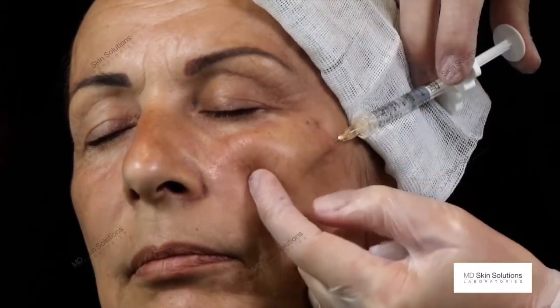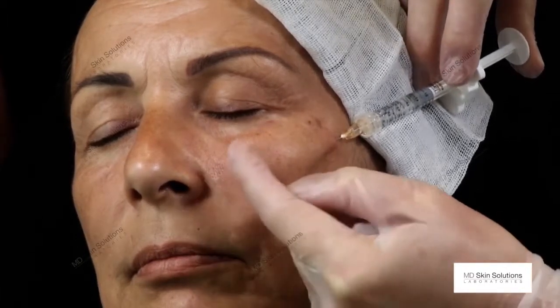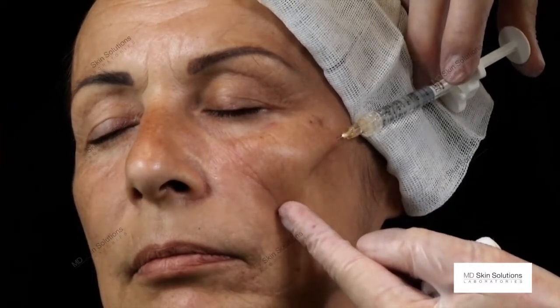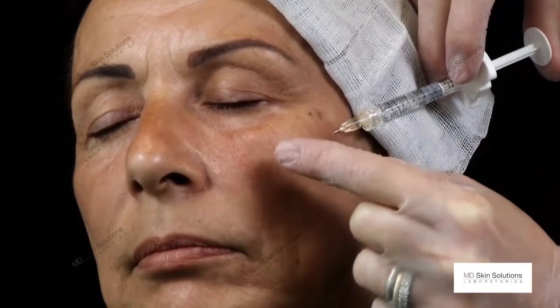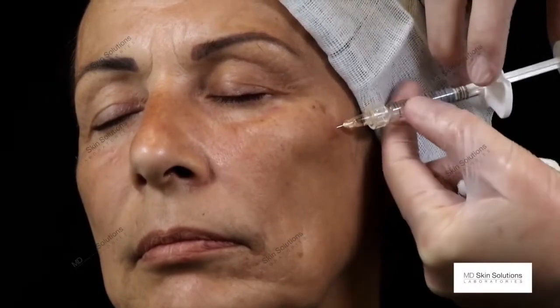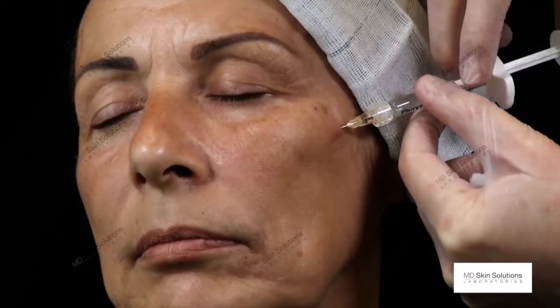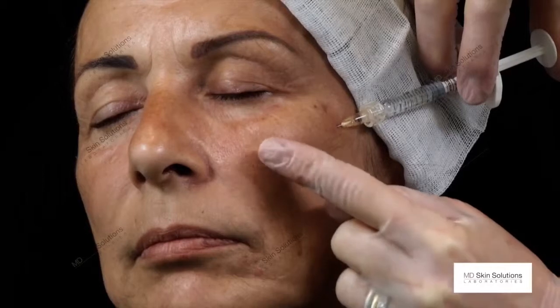Next rule is control where the tip is. When it sits exactly on this nasojugal groove, then we are on the right level or area, and level wise we're down on the bone. This cannula has a hub marking, so I know where the tip, the hole in the tip is, so I turn this down, and now the injection begins.